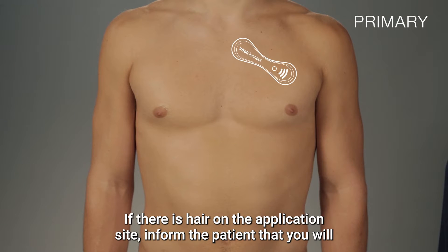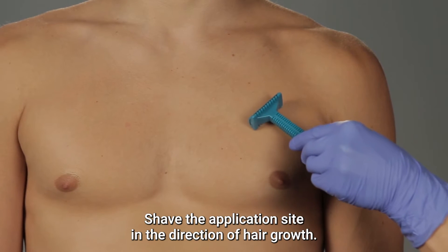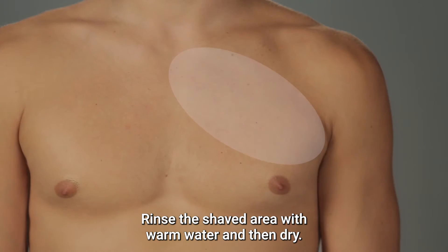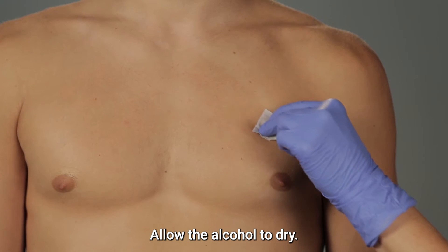If there is hair on the application site, inform the patient that you will be shaving their chest. Apply warm water and shaving cream, then shave the application site in the direction of hair growth. Rinse the shaved area with warm water and dry. For all patients, clean the application site using an alcohol wipe and allow the alcohol to dry.